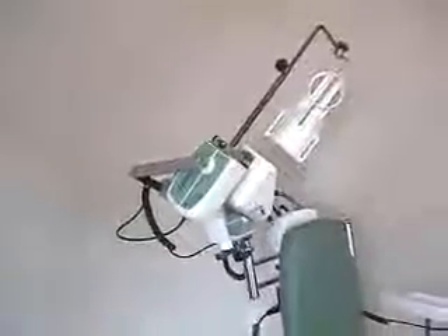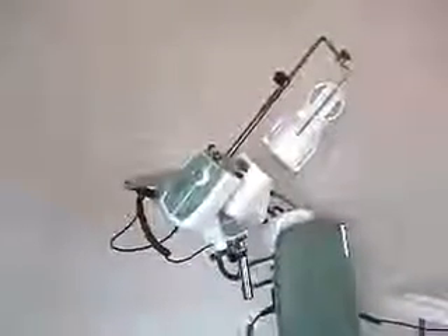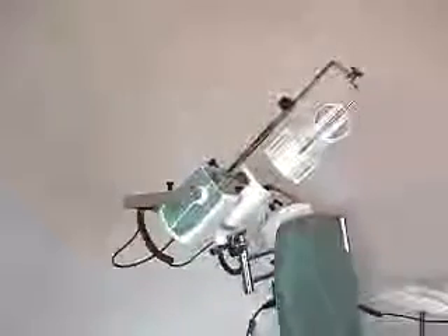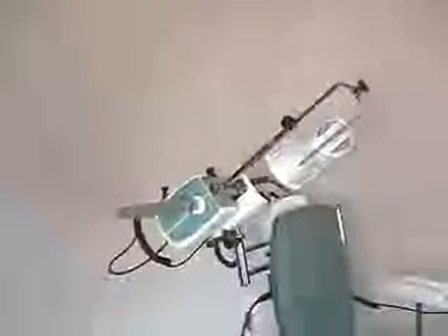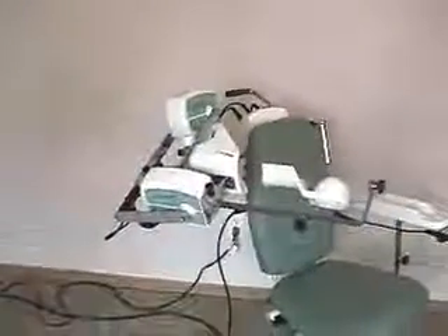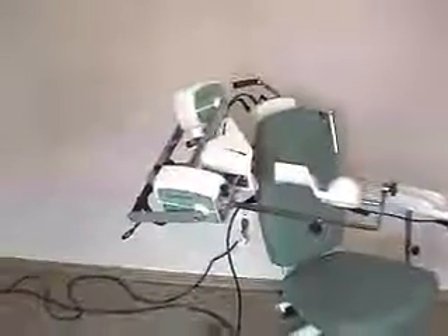By definition with the Centura Shoulder CPM, you cannot have more degrees of rotation than you do of abduction. For example, if your abduction settings are from 50 to 150, that's a total of 100 degrees. You cannot have more than a total of 100 degrees of rotation.